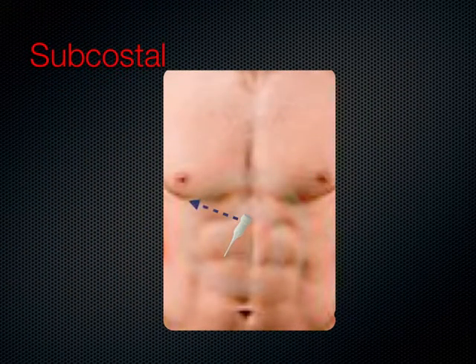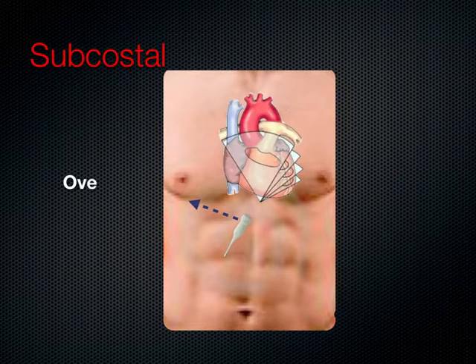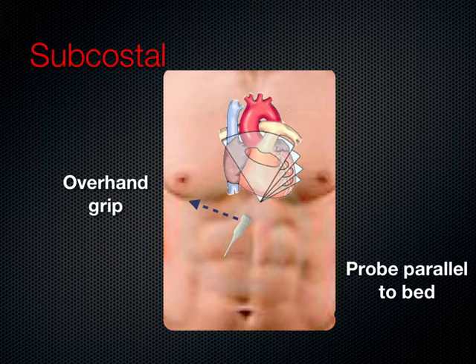The subcostal view is one of the most useful views for many of our patients, one of the easiest to train, and also the one where we can evaluate the IVC for volume status. There is an indicator on each probe that helps with orientation. In this view, the indicator is towards the patient's right. From underneath the diaphragm, we look through the diaphragm up into the thorax and view the heart. This is an overhand grip with the probe somewhat parallel to the bed, with significant pressure pushing down into the abdomen.